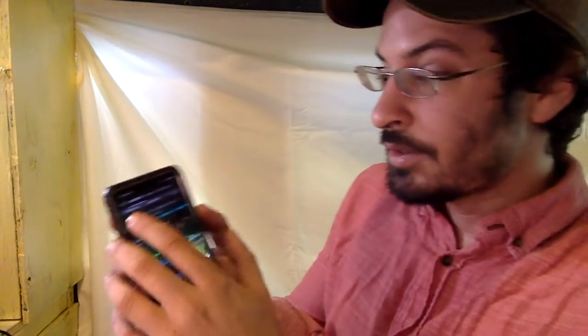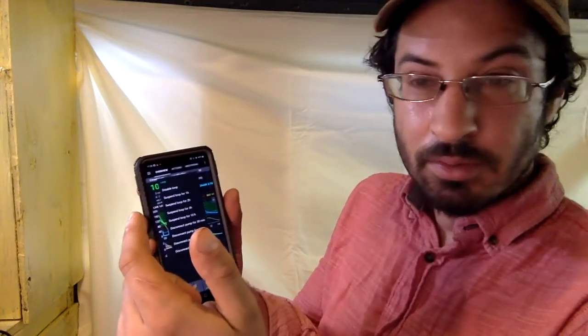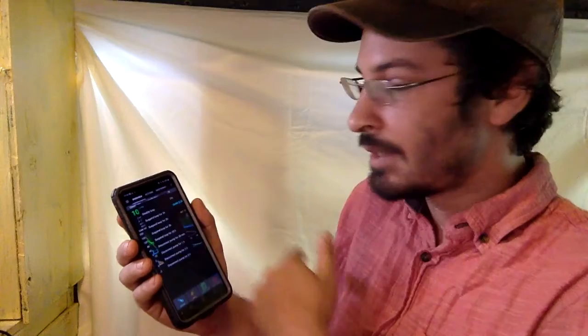So on the screen here, closed loop, I can disable my loop, I can turn the thing off, say something's broken, my sensor turned off.